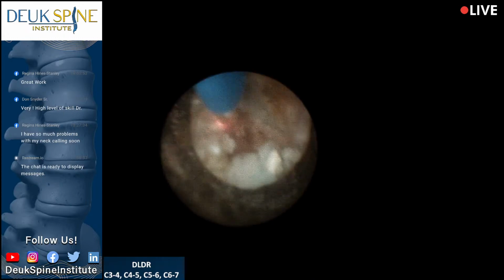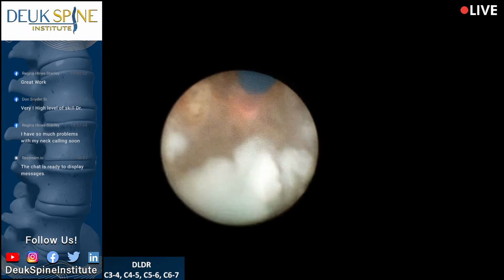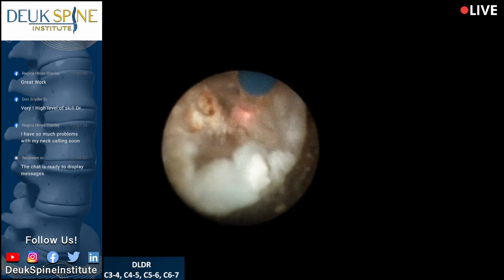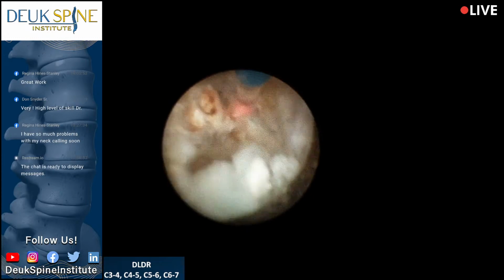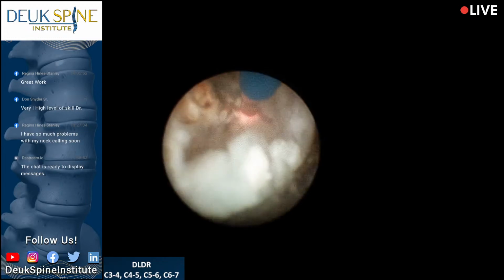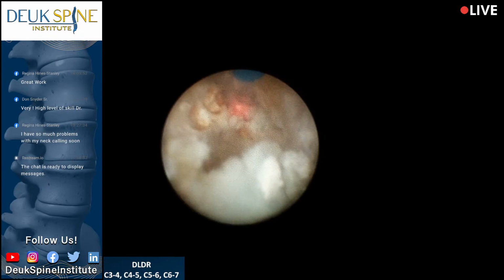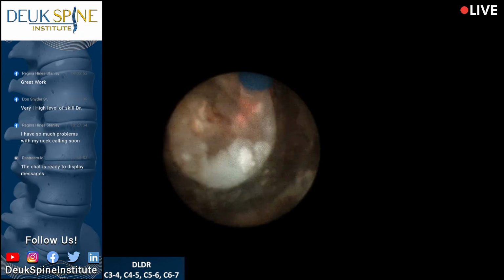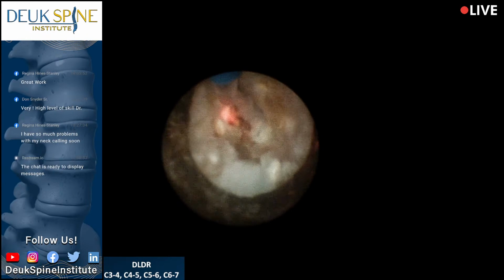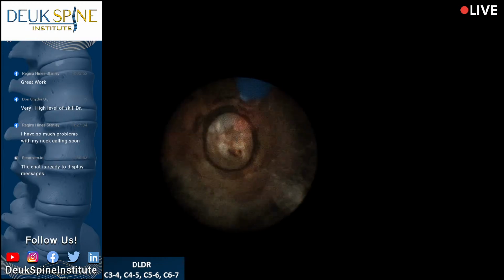Here we are at the back, a lot of bone spur, a lot of scar tissue, not as much as the last disc for sure, but definitely abnormal. And got to clean up as much as we can back here. Get the pressure off the spinal cord. You see that herniation just kind of undulating down there? See it? It's like rolling around. That's just sitting on top of the spinal cord. It's calcified. There's the uncinate process. We're kind of looking out the foramen already here on his left. That's how well placed the tube is. So we're going to have to work our way back to the other side.